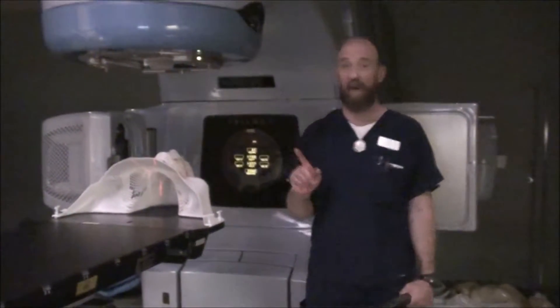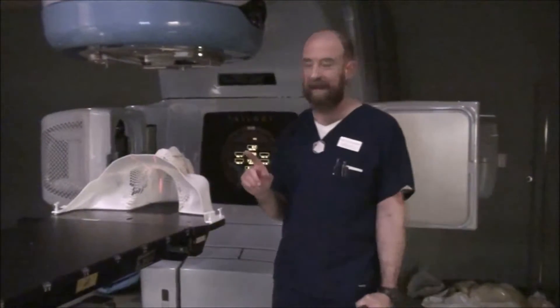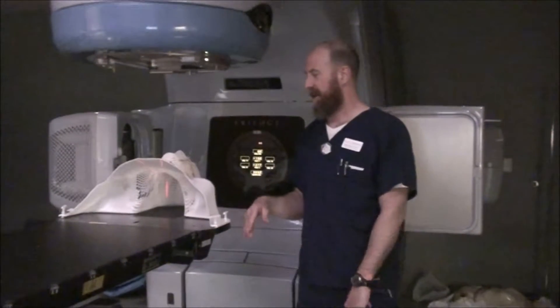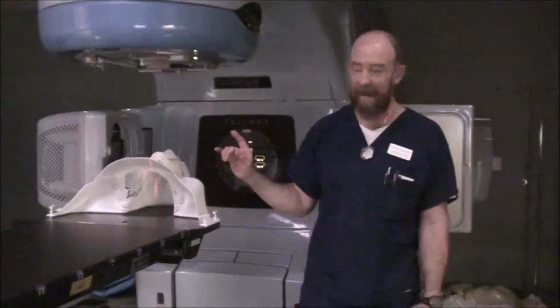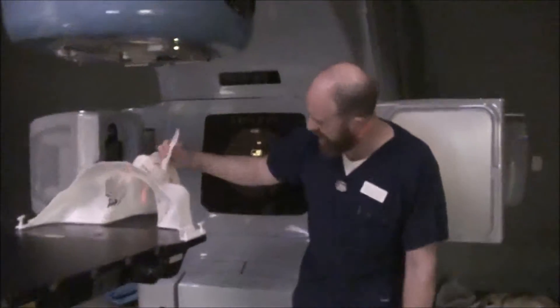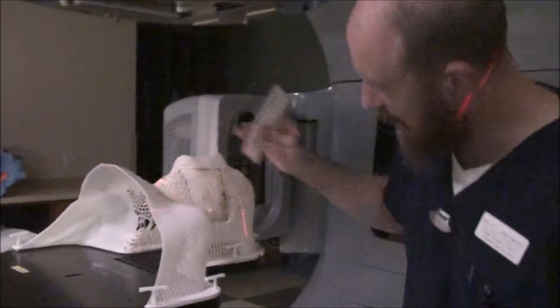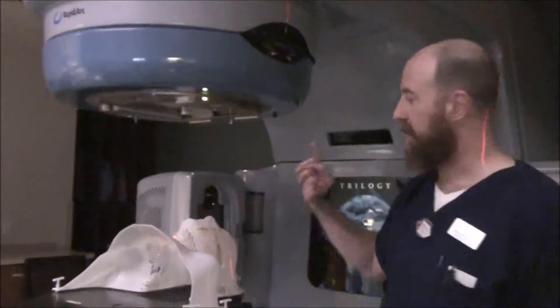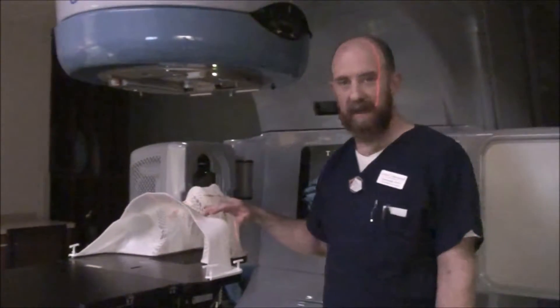You're going to go in-out to the thyroid prominence. You're going to set up-down to whatever your facility decides. You can have 100 SSD, 97 SSD, or some other depth. I'm going to leave this ballpark to where I had it in the first place, which gives us probably about a 97 or 98 SSD at the supraclavicle. We're going to set it to width so that it's out to the clavicles, down to the SSCN, CR at the thyroid prominence — all the same things we did before.